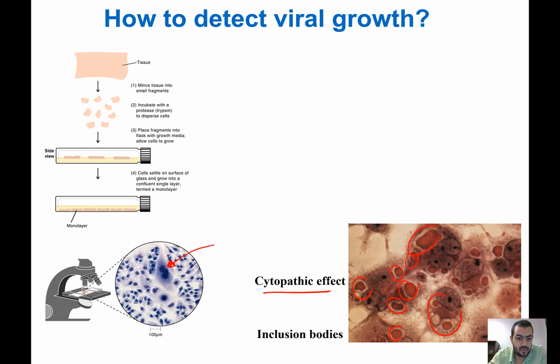Remember, here you are examining the cells. That's why you are examining it under the normal microscope. You are not actually observing the virus itself. You are observing the damage in the cells caused by the virus. And since the host cells are large enough, they can be examined by this simple microscope, the compound light microscope.